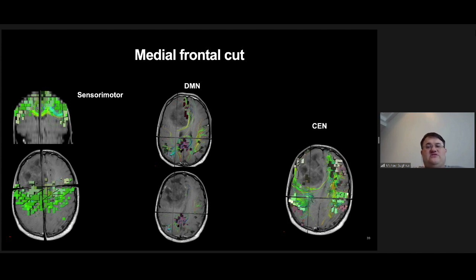What we do know is that it's giving you fairly plausible and believable data on where the likely locations of these networks are. And how we would utilize this in surgery is to make cuts like we're demonstrating here, and then if you advance it, and here, to safely remove this tumor.